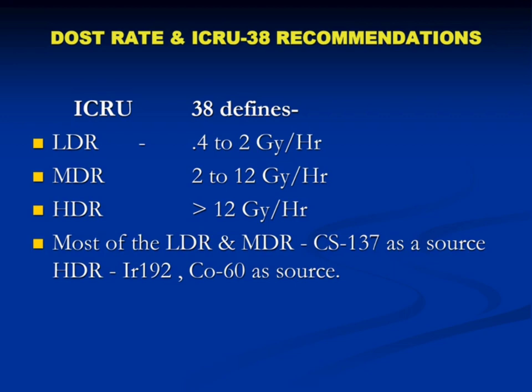Why do they have to do it? Because we know the uterus is usually anteverted, anteflexed, and if the uterus is anteverted, anteflexed, everything is fine. But suppose the uterus is retroverted, retroflexed, what will happen to point A? Point B will remain on the same axis, but point A will change, so all the calculations will be different. So they recommended calculating the reference volume and treating the tumor accordingly.